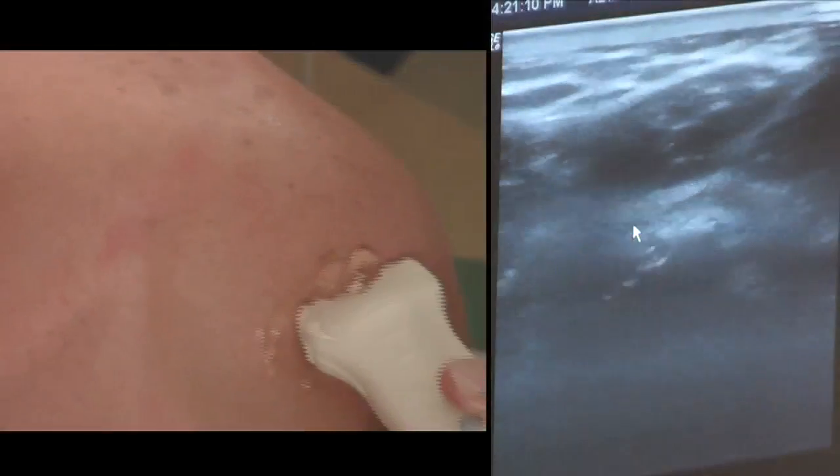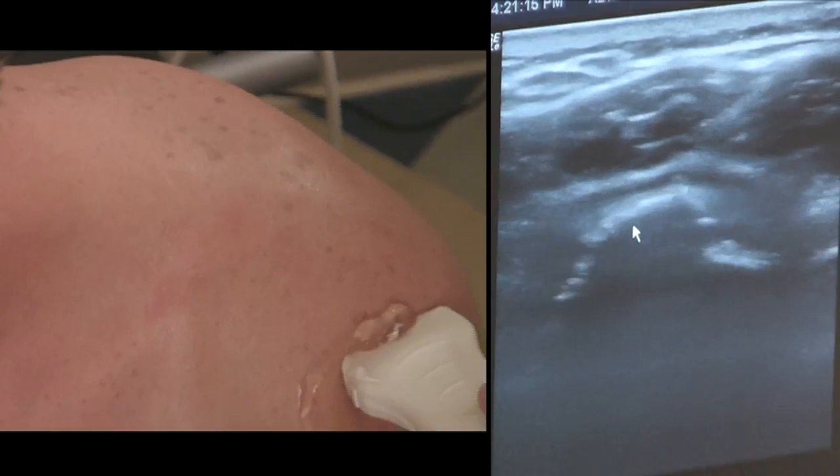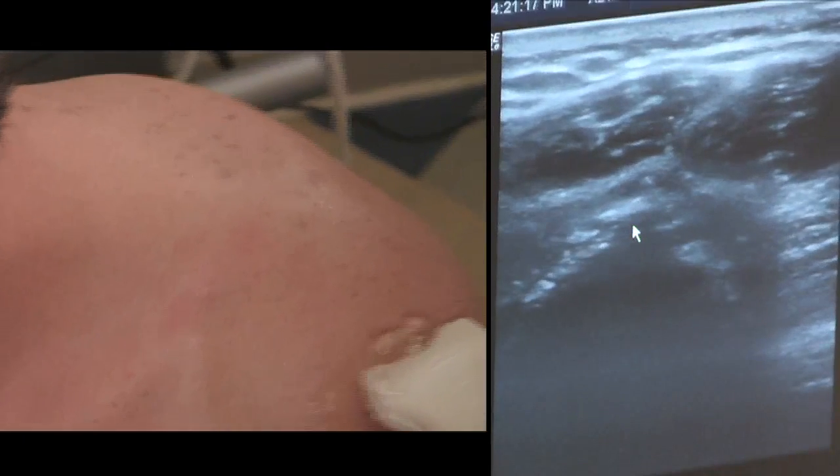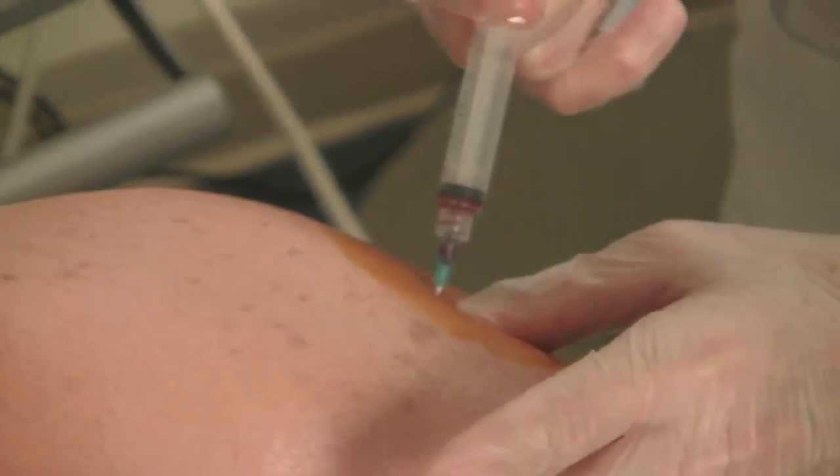In this image on ultrasound, you can see the internal structures of the shoulder. You can see the humerus where it meets the joint of the glenoid. Here you see me injecting the PRP solution into the shoulder.